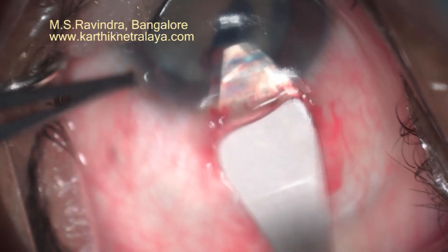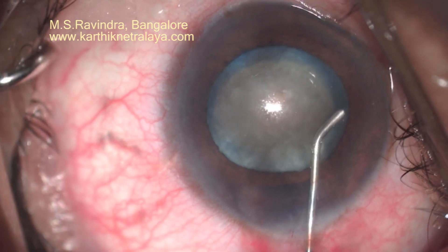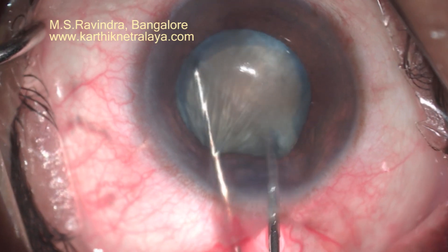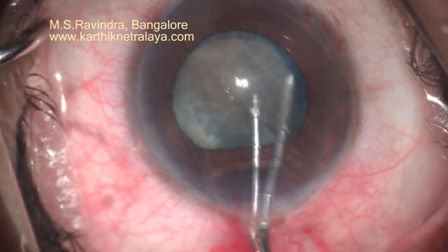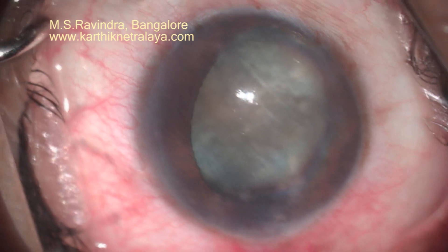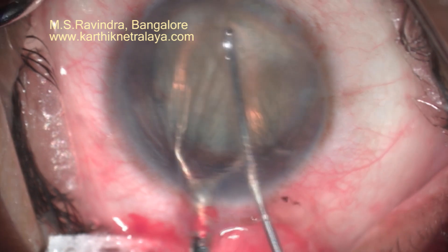The rhexis is not central but it's intact — that's extremely important. Lignocaine 1% in the anterior chamber: a very little amount is infused behind the iris. Rotate the nucleus manually using a 25-gauge cannula and a Sinski hook. See that the center of the nucleus remains in the center of the pupil so that you are not applying pressure on the zonules.